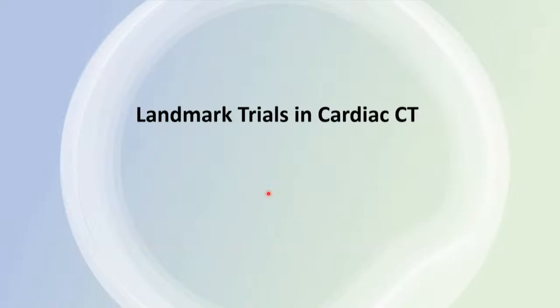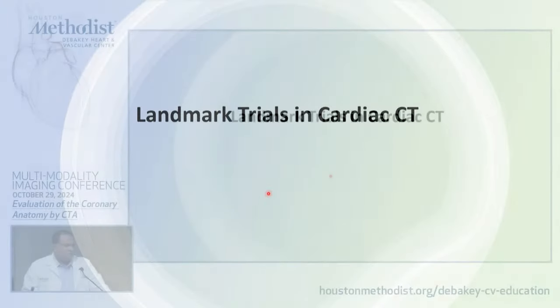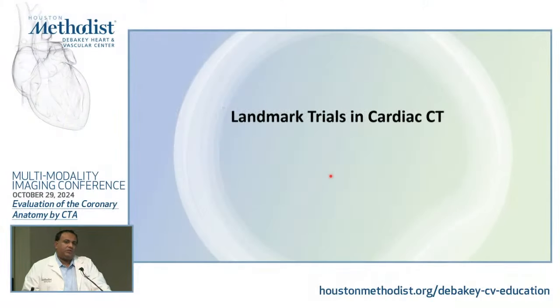So I talked about these landmark trials when I gave this talk last year as well. I'm going to make this shorter because we're going to talk more about future directions towards the end. The 3 landmark trials that I listed were the ROMICAT, the PROMISE, and the SCOT-HEART. The SCOT-HEART is an important one because you'll see a lot of the later slides that talk about new technology. A lot of that new technology has actually utilized the data from the SCOT-HEART trial to see how that technology works, because they have data for outcomes in those patients for over 5 years.